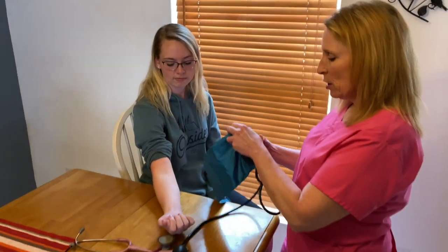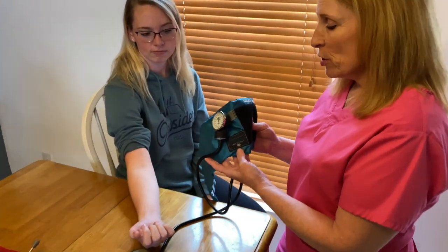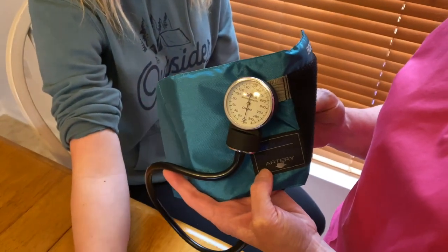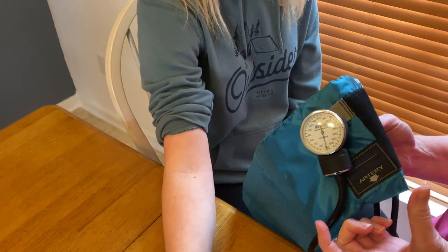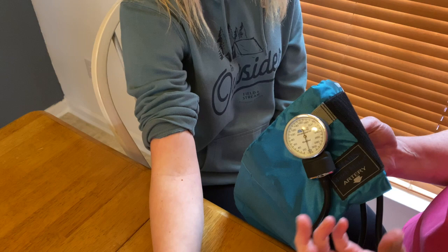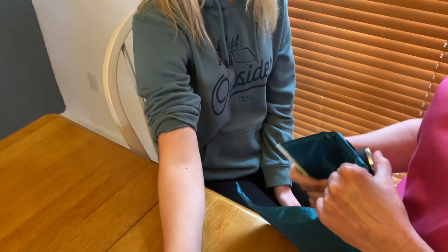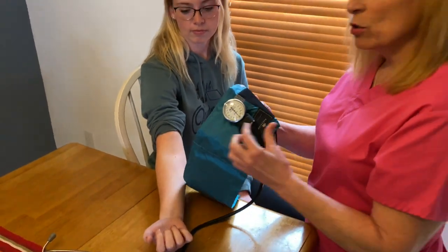So now I'm going to place my blood pressure cuff. And on this particular blood pressure cuff, I have one arrow. So this one arrow is going to be placed over the brachial artery, 2 inches above the fold of the arm. In some other blood pressure cuffs, there might be 2 arrows indicating a left and right arm. So you would place that appropriately. So I am using her right arm, and it really doesn't matter in this one because there's one arrow.